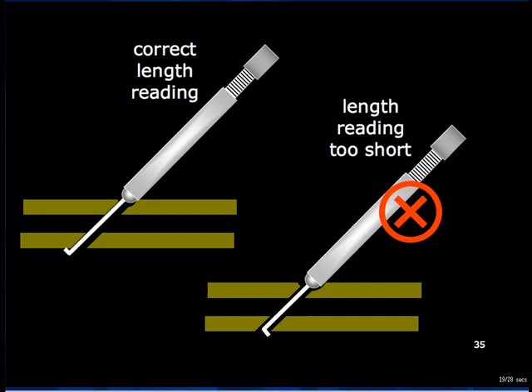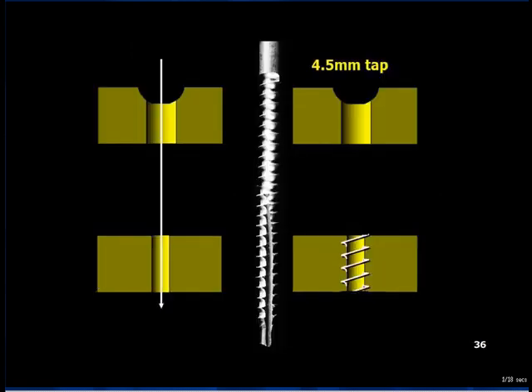If this proves impossible, then hook onto the acute angled side of the screw hole and then add 2 or 4 millimeters depending on the obliquity. Following depth measurement, the correct length of screw is chosen. The final step is to tap the far cortex. This is a precision maneuver, and the use of the tap requires great skill and surgical discipline.